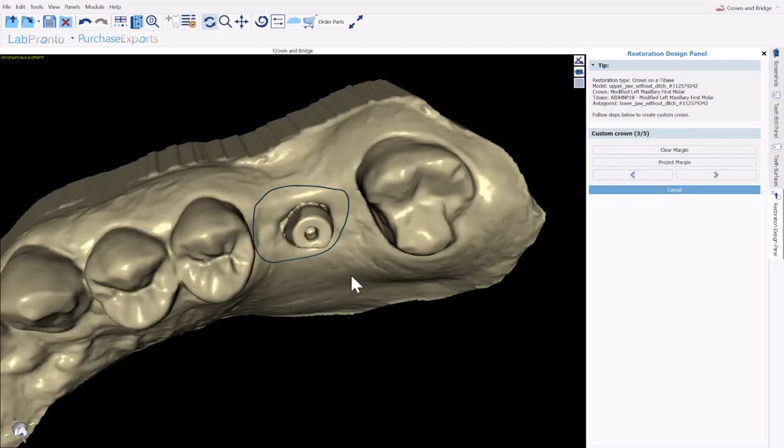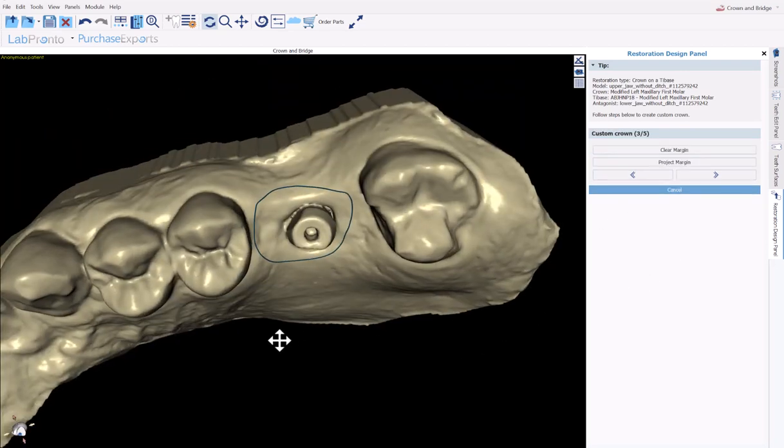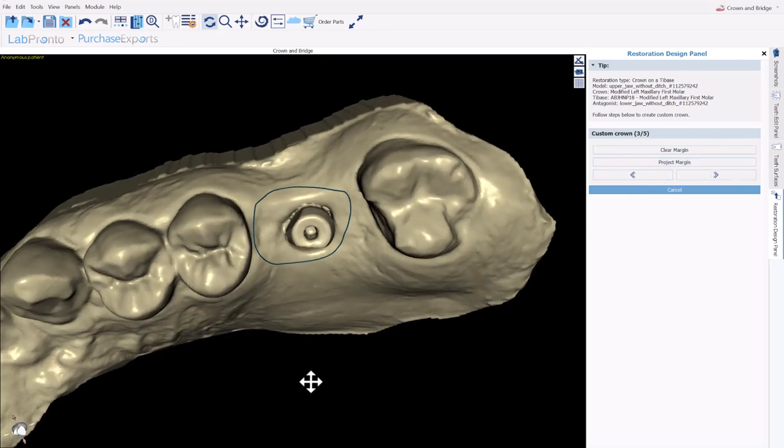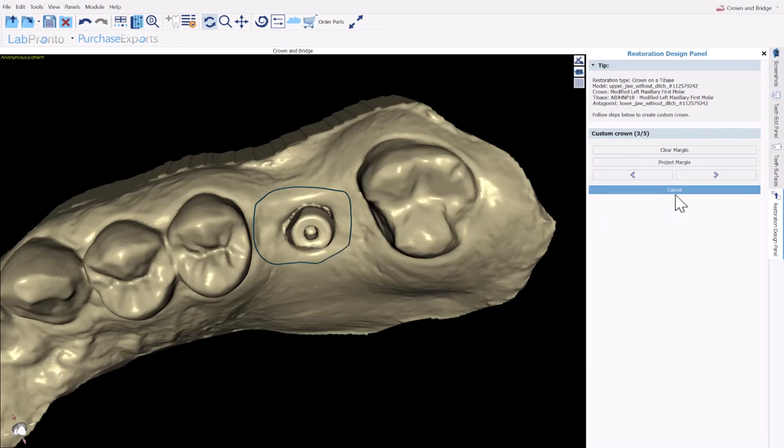The margin curve can be drawn as needed. If you'd like to project and have it drawn automatically based on the placement of the tooth, click project margin. And if you need to modify the shape or the placement at all, hold down the shift key, use your left mouse button and just draw where you'd like the margin curve to be. Once you have completed that, go ahead and click on next.